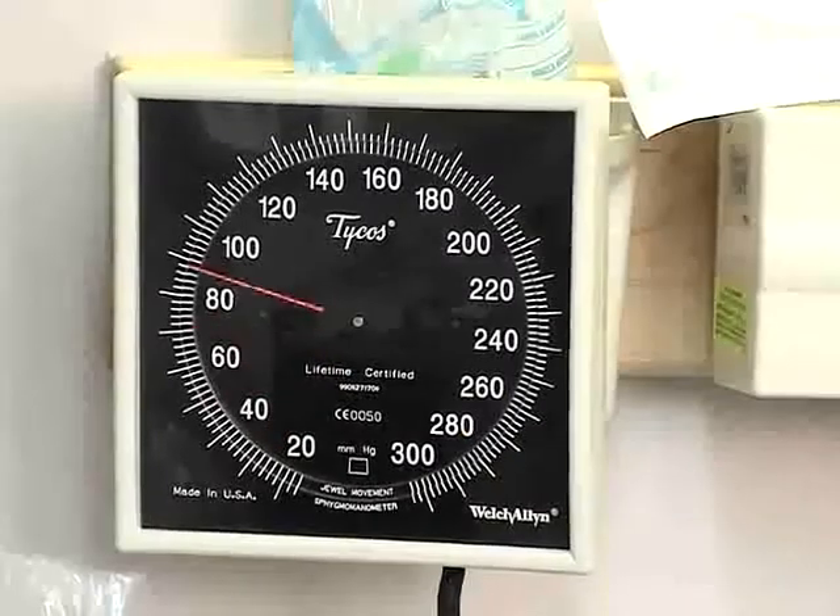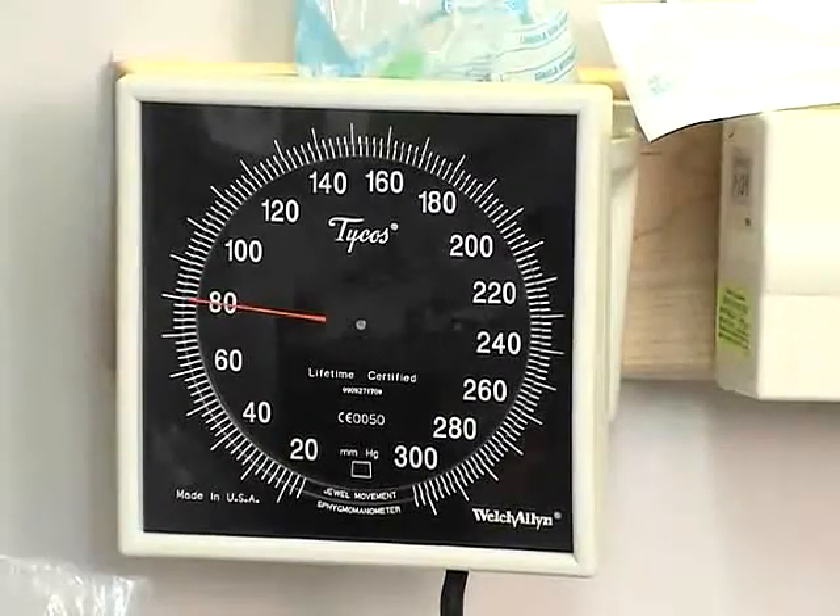The cuff should be inflated to a value just below the diastolic pressure.